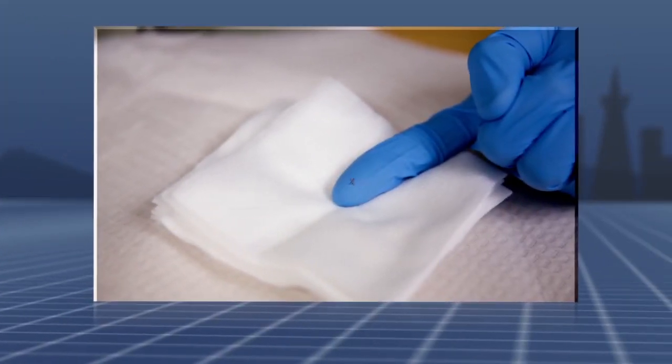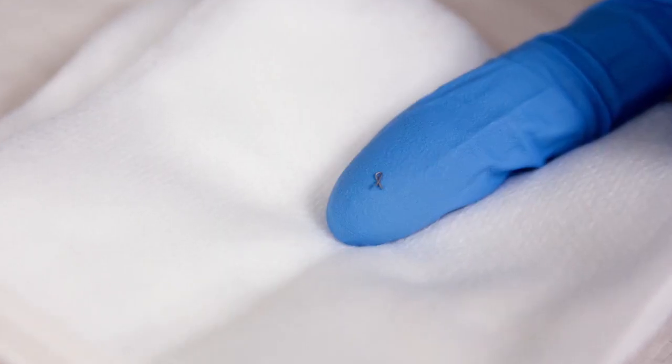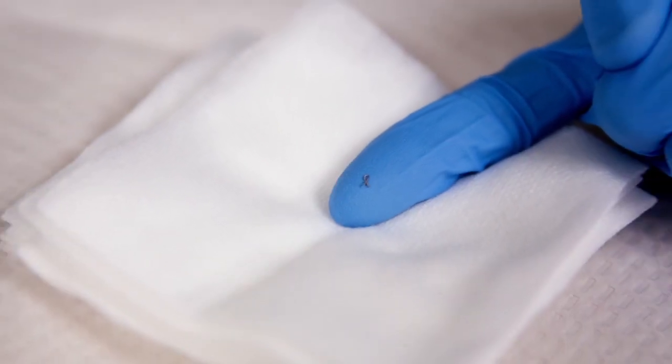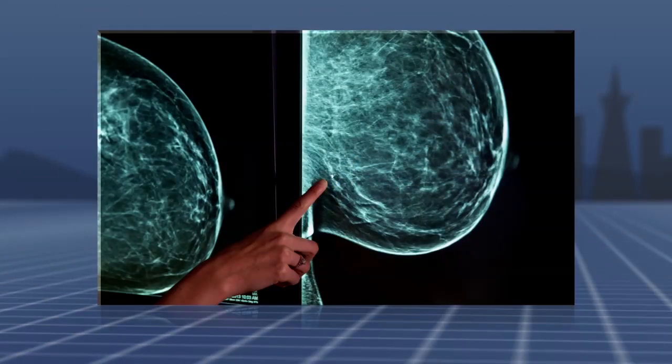Then the doctor will place a tiny marker, the size of a sesame seed, at the site. This marker is very important as it marks the location of the biopsy — information that is required if any further intervention is needed.